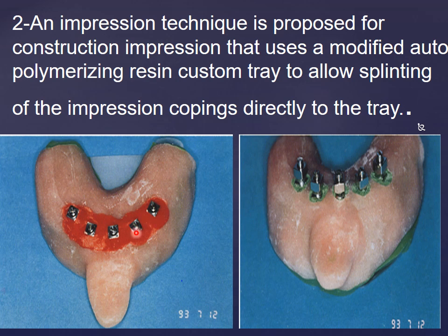Here we construct this part by using wax around each impression post, and then we can take the impression by using a special tray.